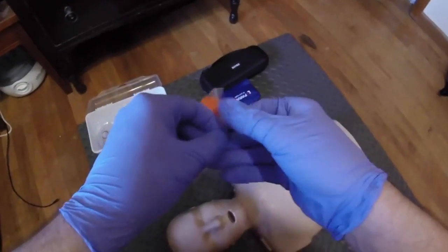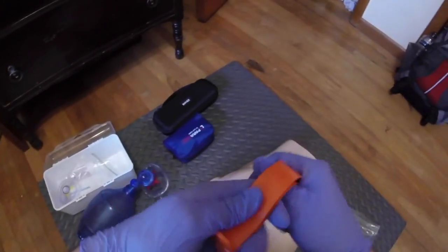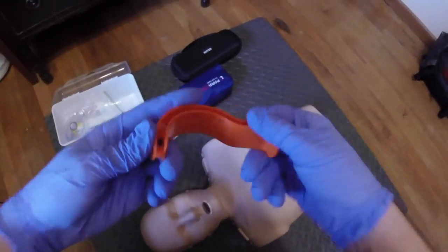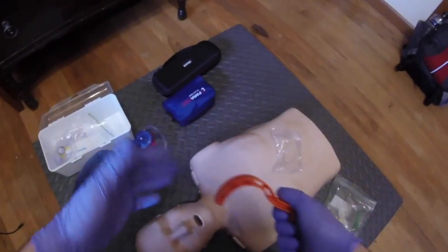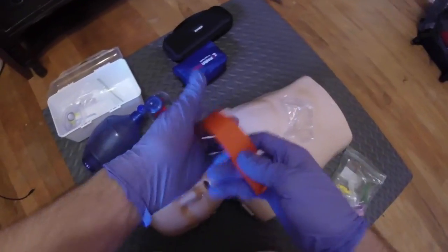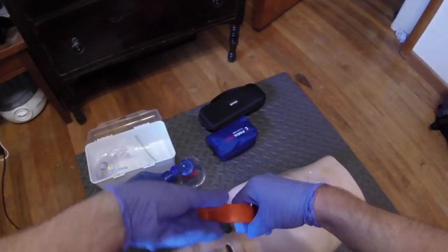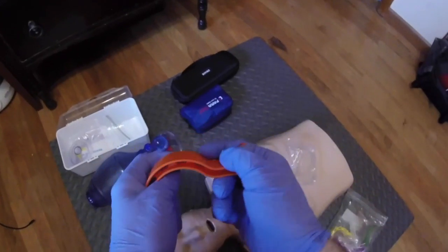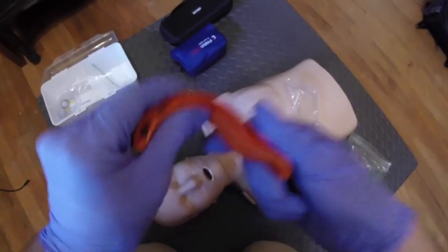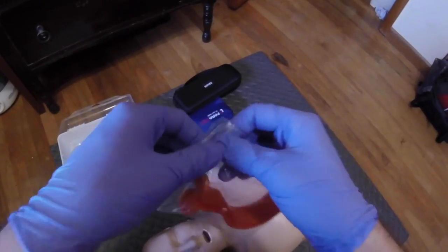I'm actually testing on airway management next week on my birthday. An oropharyngeal airway is for an unconscious patient with no gag reflex — the patient will not gag when I put this into their mouth. If they do have a gag reflex, I would immediately take this out and prepare to suction because they might vomit. The way you insert it is you face the device away from the tongue, insert it until you meet resistance, then do a 180-degree turn and follow the curvature of the airway. This prevents the tongue from falling back and causing an obstruction. We use this device quite a lot in EMS.